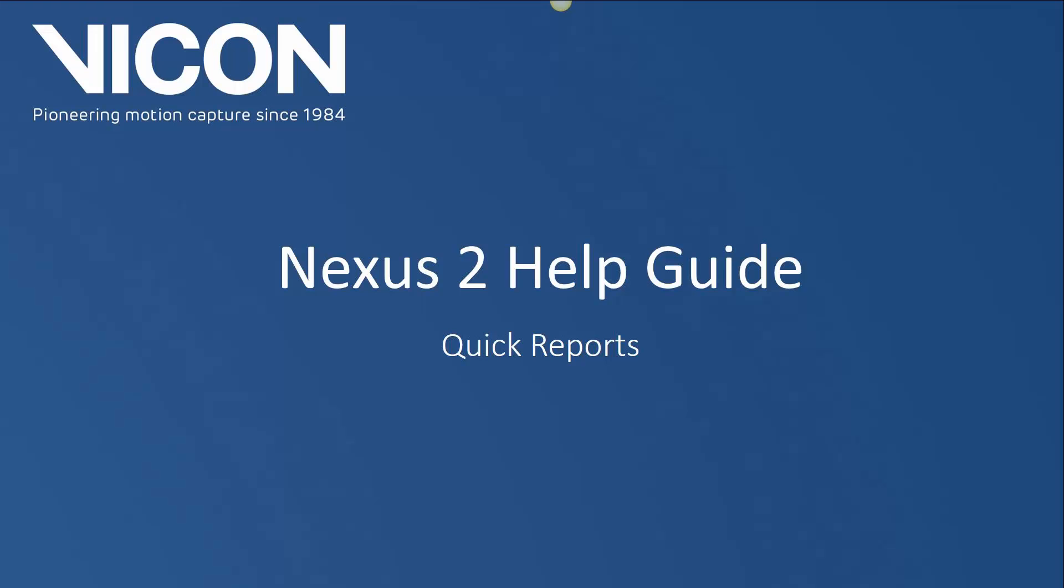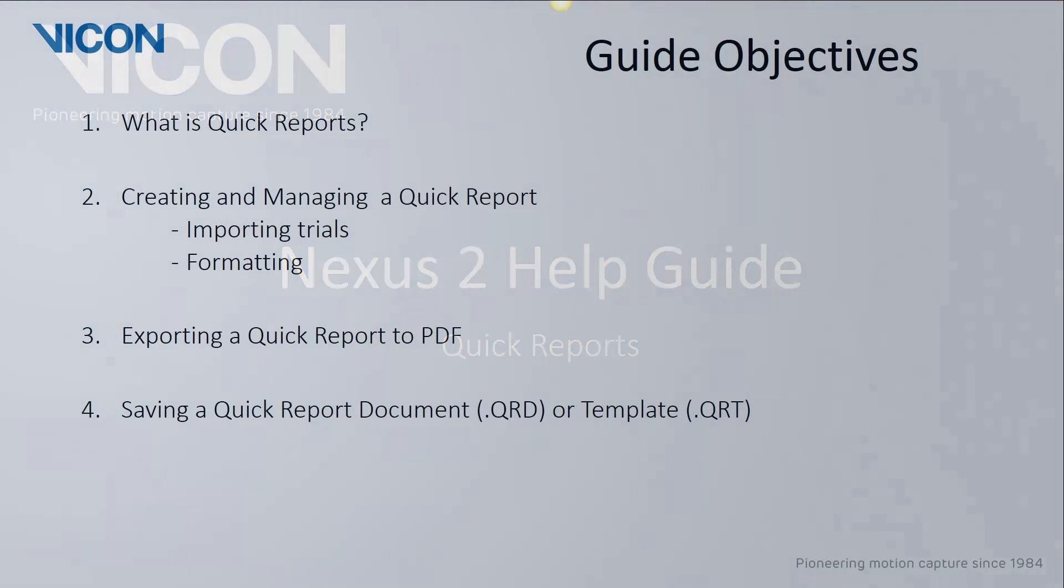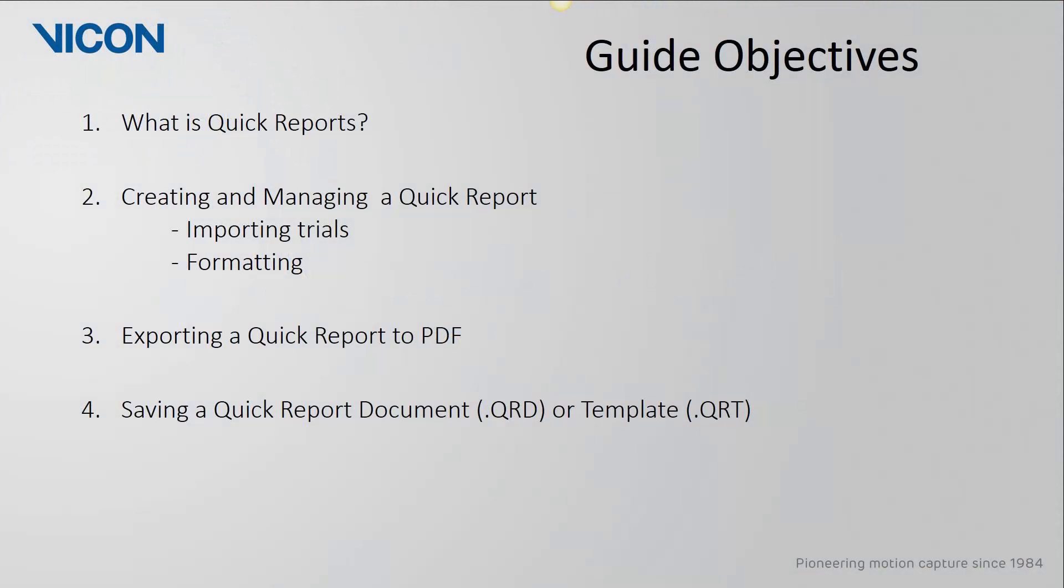Welcome to your Nexus 2 help guide. This session is on quick reports. In this guide we will first start with a brief introduction into quick reports. We will then discuss how to create and manage a report. This will include how to import trials and how to make changes to its format. We will then look into how to export the report and the options available for saving the report or using the current report as a template for future reports.